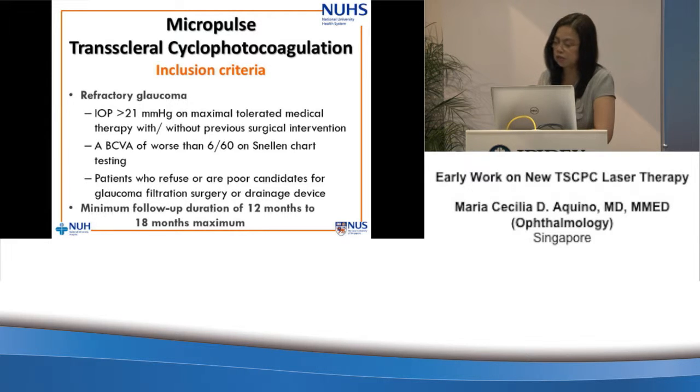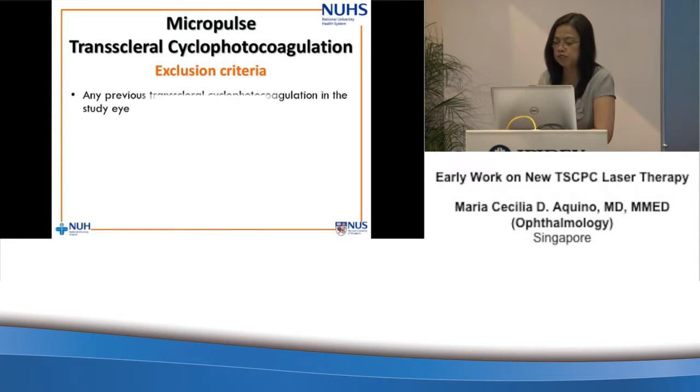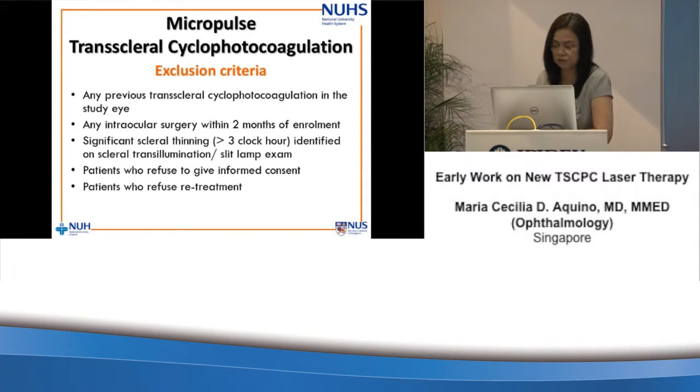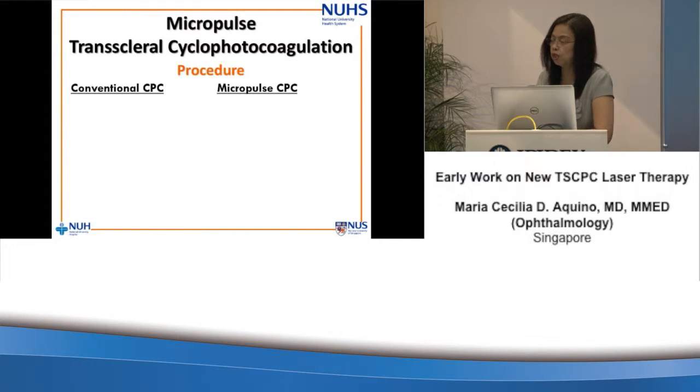So the exclusion criteria: any previous CPC in the eye, any intraocular surgery within 2 months of enrollment, significant scleral thinning of more than 3 clock hours, patients who refuse to give informed consent, and especially patients who refuse retreatment. So these are the settings that we used for this comparison.